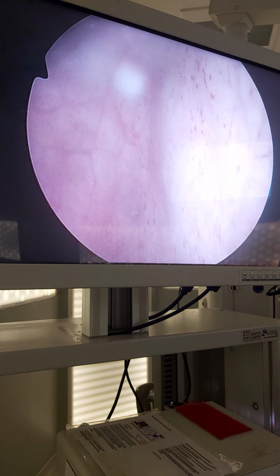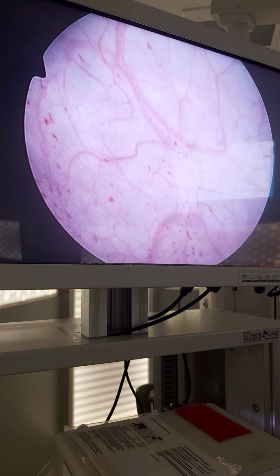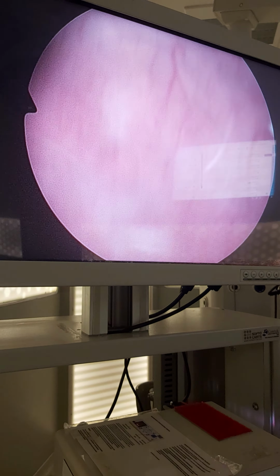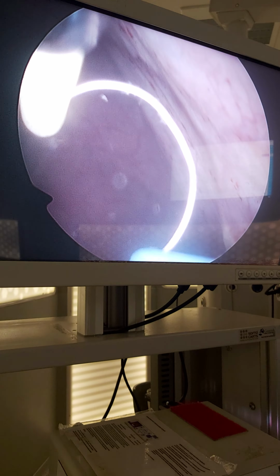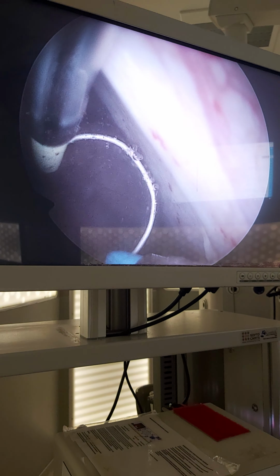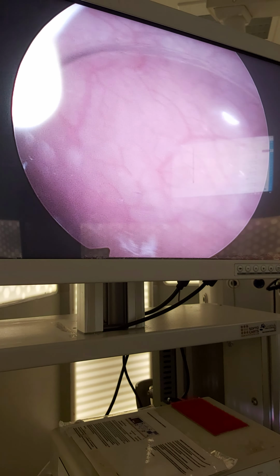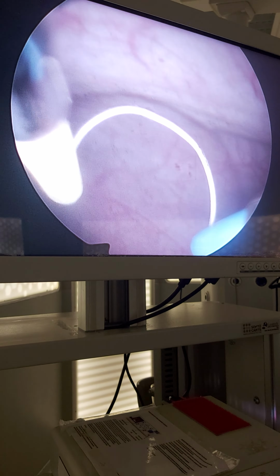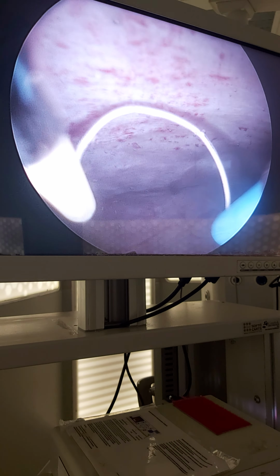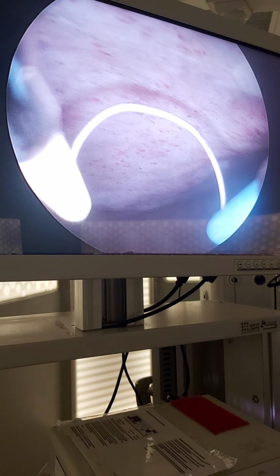Why do I do this? Because we know that when we fulgurate some part, the newly formed mucosa is a little different than the original one, and it's proven that it's more resistant to infections, because it has more vessels inside. Of course, this is another theory of mine, which is not proven as usual, which is not done by others as usual.